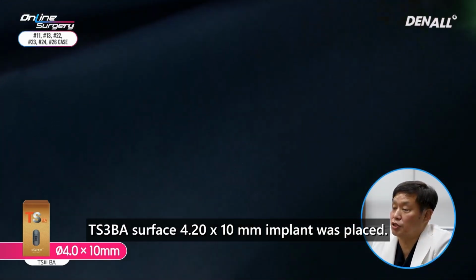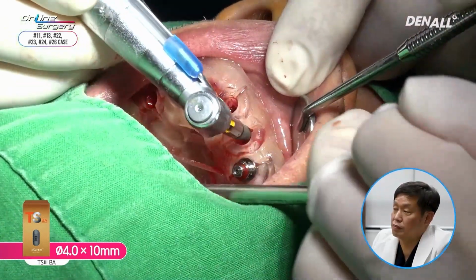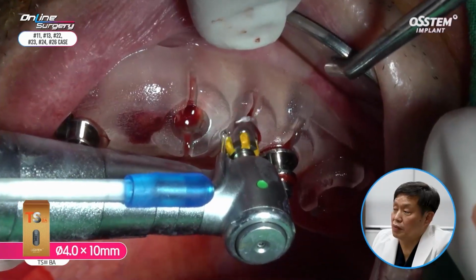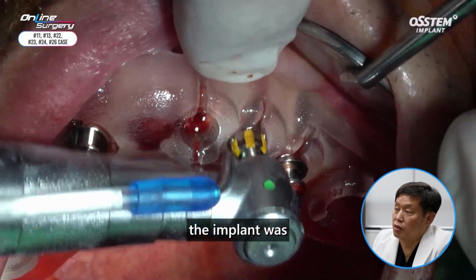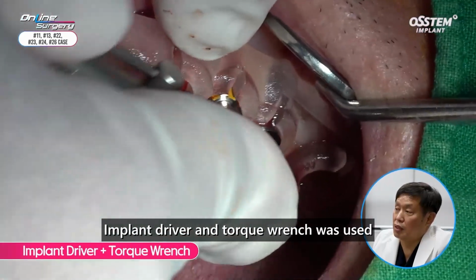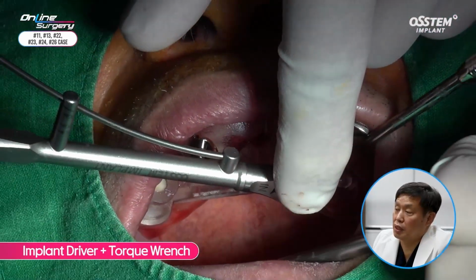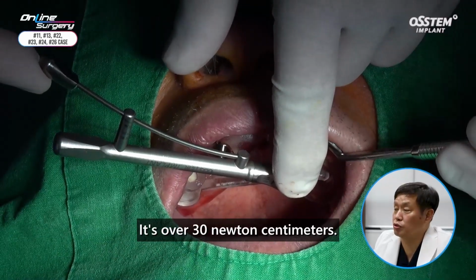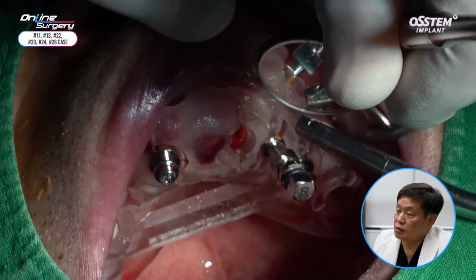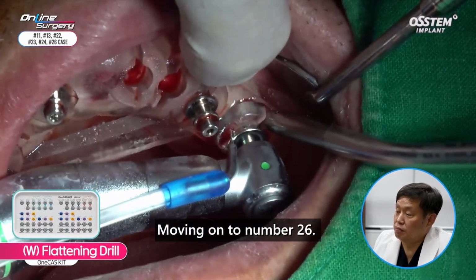TS3 BA surface 4.0 by 10 millimeter implant was placed. In the canine area, the implant was placed about 80% using the engine. Implant driver and torque wrench were used to adjust the depth and hex position. It's over 30 Newton centimeters. That was how number 23 was completed. Moving on to number 26.